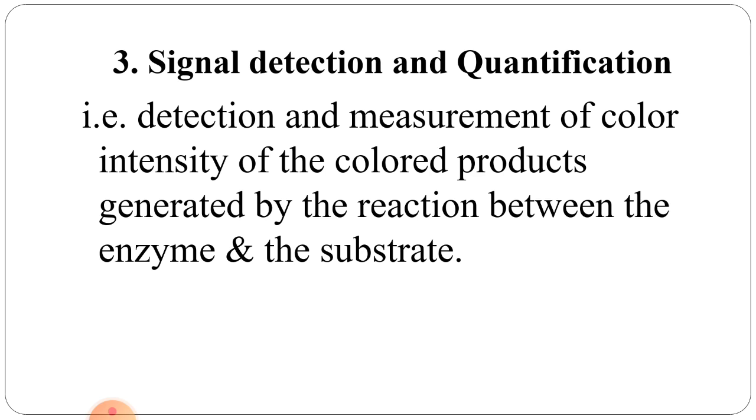The third principle is signal detection and quantification, that is, detection and measurement of color intensity of the colored products generated by the reaction between the enzyme and the substrate.